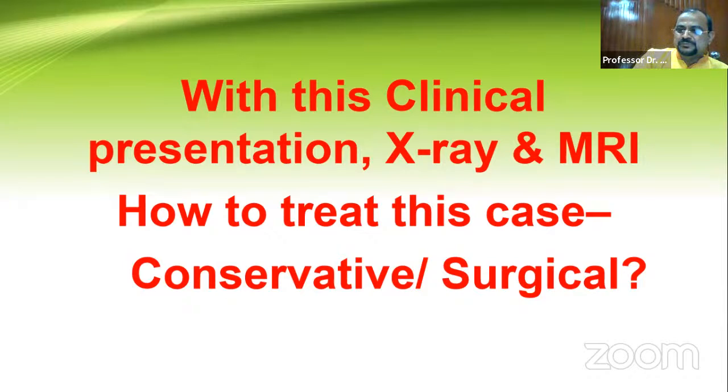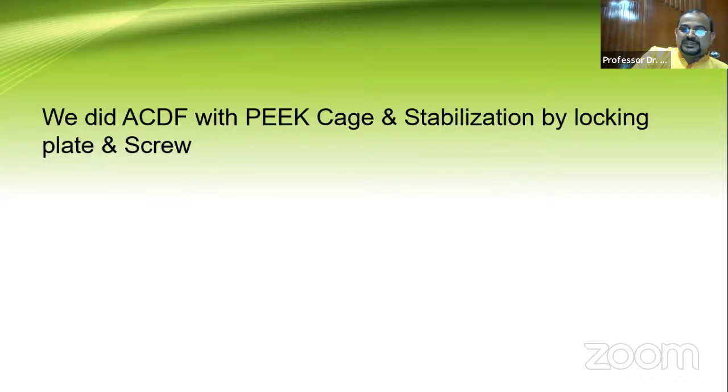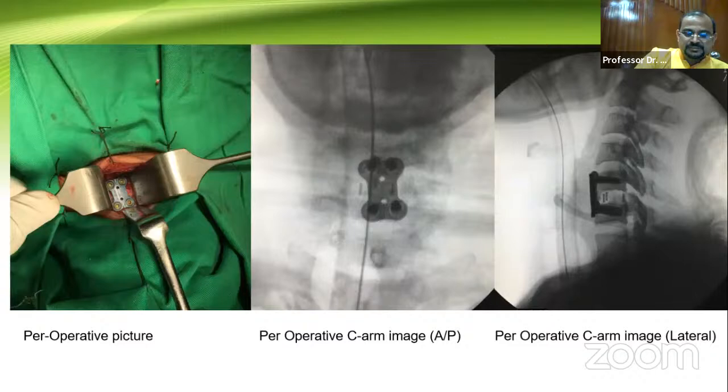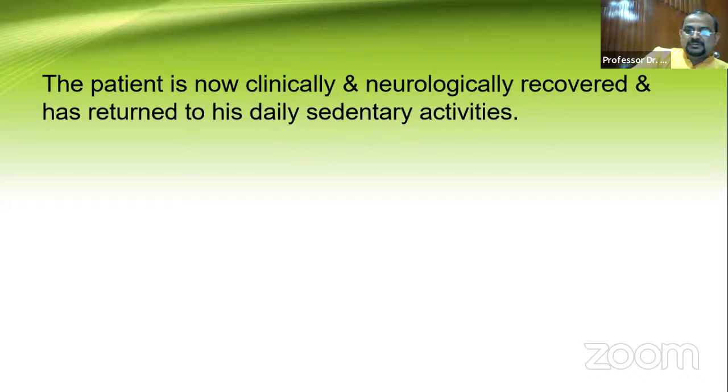No, I do agree with Sudhir. Thank you, sir. We did ACDF with PEEK cage and stabilization by locking plate and screws. This is the peroperative photograph and the AP and lateral C-arm images. So this is the postoperative X-ray after a few months. The patient is neurologically okay now and has returned to his normal activities. As you are saying, sedentary workers, so he returned to his sedentary activities.